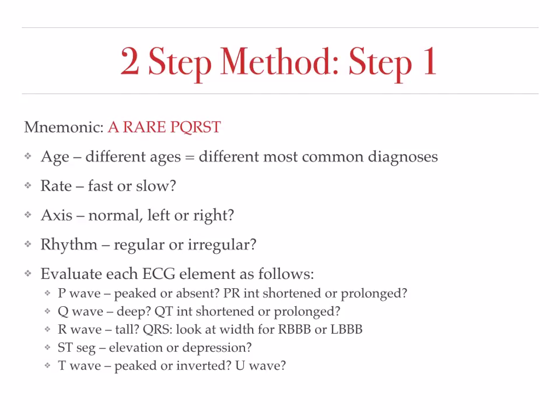So look at the P wave. Is it peaked or absent? Is the PR interval shortened or prolonged? Are there any signs of heart blocks? Look at the Q wave. Is it deep, indicating signs of prior infarction? Also, look to see if the QT interval is shortened or prolonged.